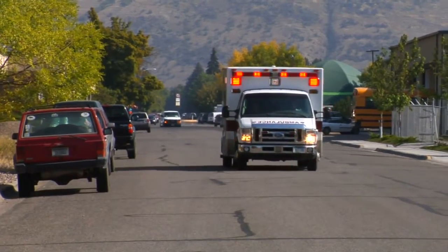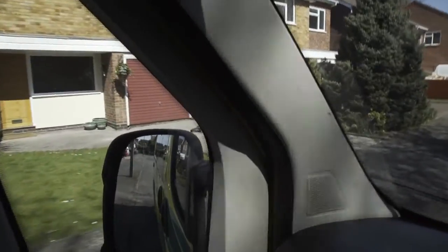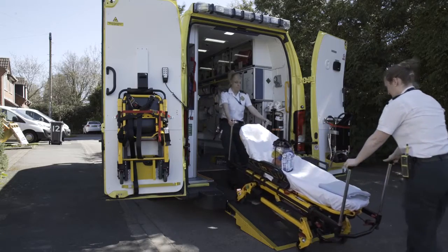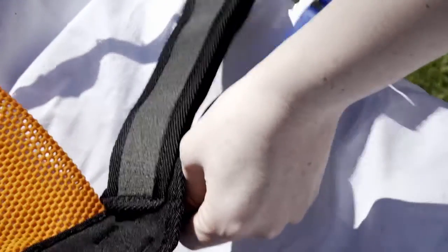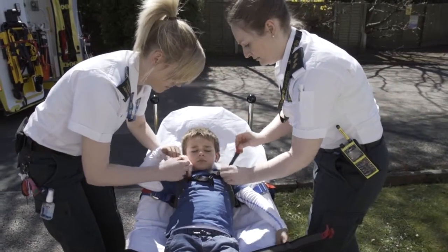The ACR is used to secure a child to a cot when being transported in an ambulance. If the child is not secured properly, there is a risk they could become dislodged — for instance if the ambulance is in a road traffic collision. The ACR is very simple to operate, quick to use, and comes in a variety of sizes, meaning you can safely secure different sizes of children to the ambulance cot.